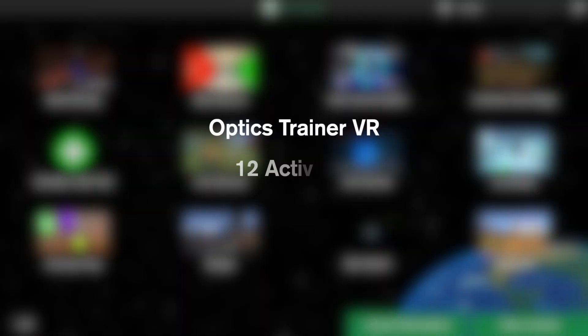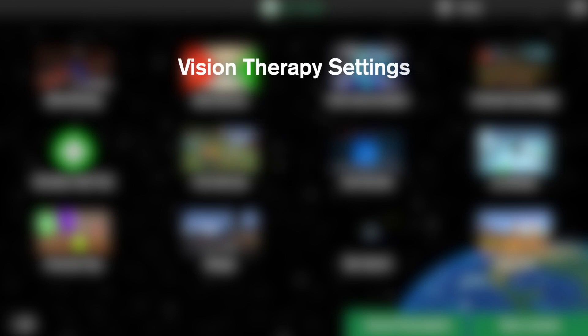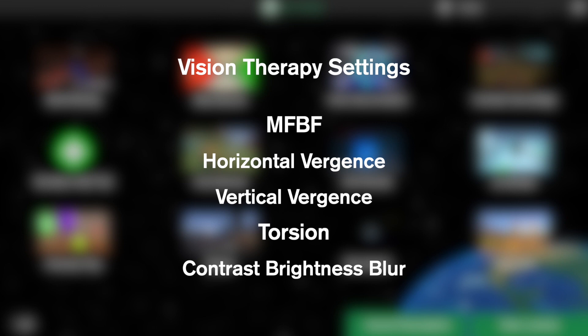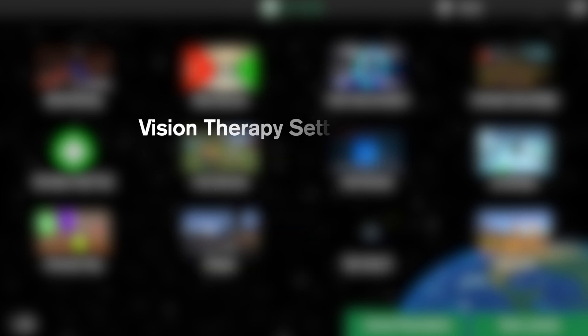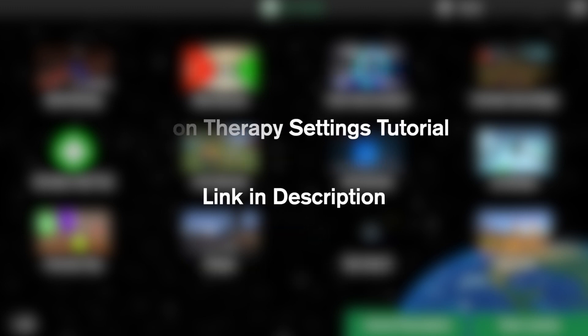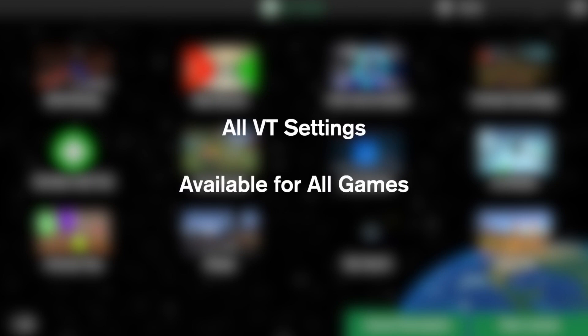Optics Trainer VR features 12 activities which includes 11 games and one test. As discussed in our Vision Therapy tutorial video, our VR system is designed specifically to treat strabismus and amblyopia. To view the full tutorial on how to use these features, please refer back to our Vision Therapy settings tutorial video. All the activities we are going over in this video can utilize all the Vision Therapy features demonstrated previously.